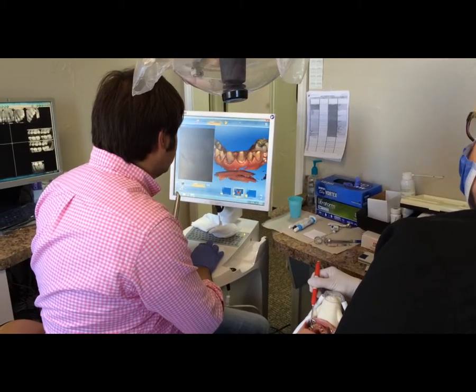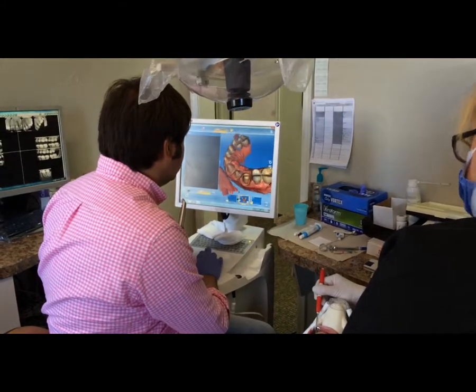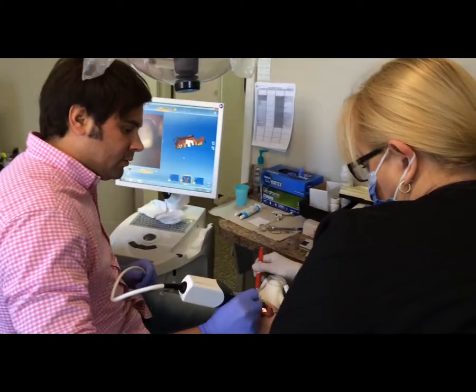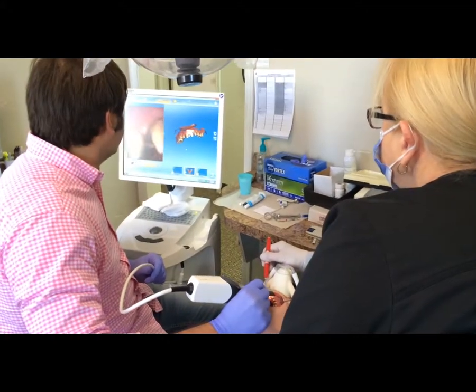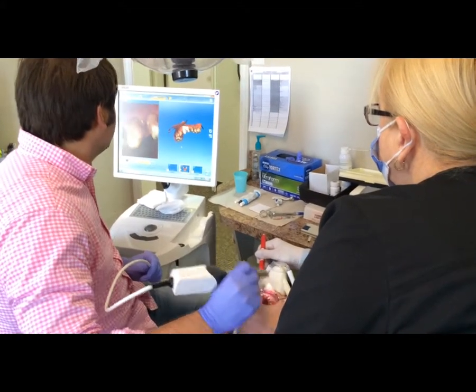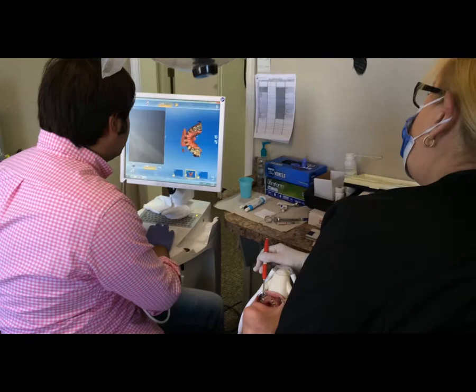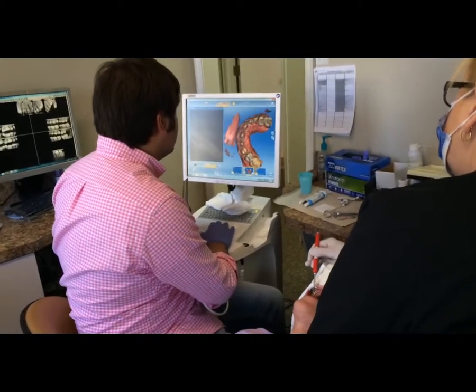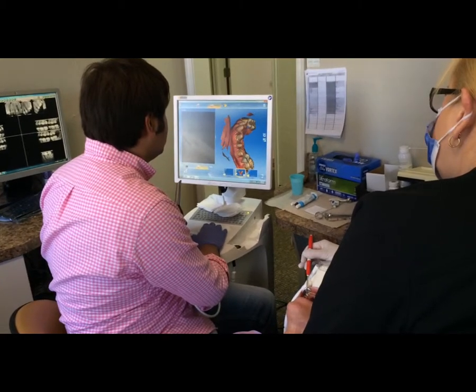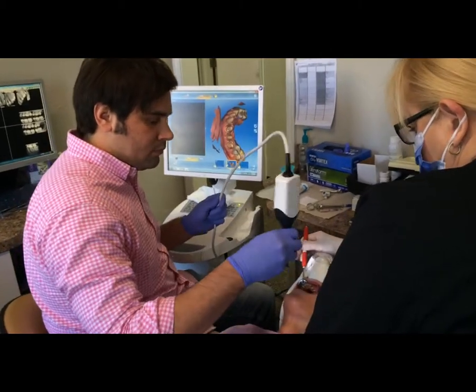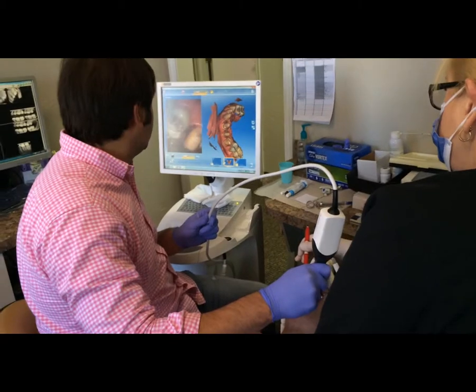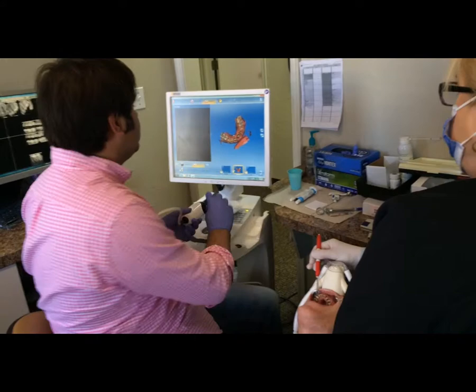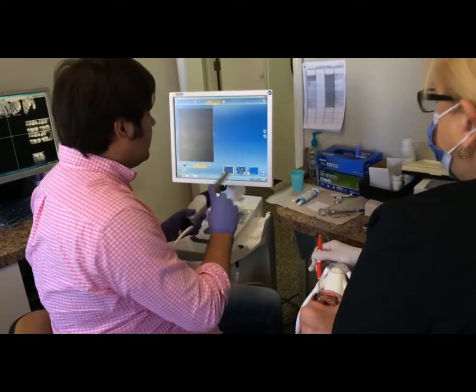He can zoom in on the images acquired to get a good look at what is needed for a good impression. Once he goes back in, the scanner and its software will automatically find the position where he last scanned, auto-stitch to that point, and start acquiring information needed in those areas. He repositions the scanner, goes back in, begins scanning again, and when he is done he checks every time.